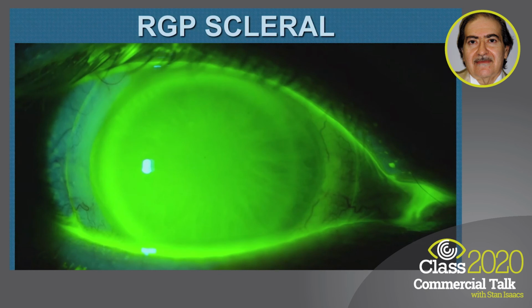So this is what will be your lens which you receive. You have a nice clearance throughout the whole cornea. You have a little bit of a ring around the limbus. You have touch on the scleral junction, on the sclera, and you have a little bit of a nice edge, right? You have to make sure you are not pinching onto the little vessels, and you need to make sure you're not touching the corneal scleral junction, like I said, which is not very good for the eye.